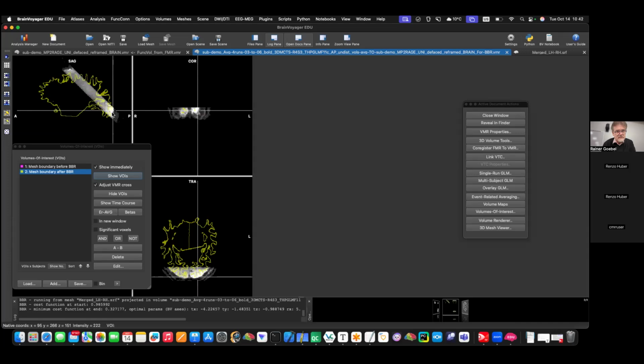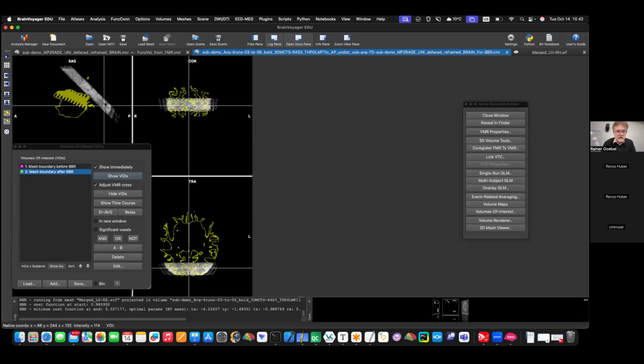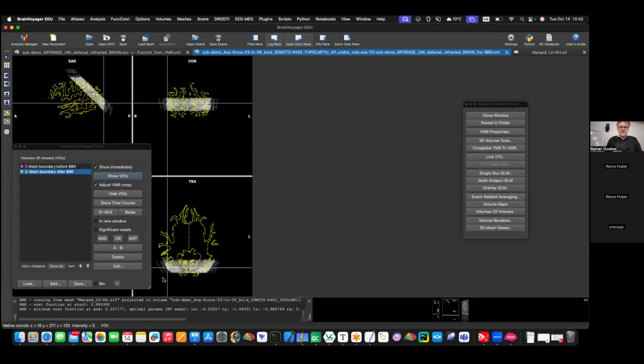It's not so well visible. That's why also the value is only 0.3 at the end. But it's pretty good. You see it maybe better here. You see here the contour, how it nicely follows the white matter, which is a bit darker, and outside is white, which is the gray matter. Also here, you see how that nicely follows this. So this worked very well, despite not much contrast differences between the two.